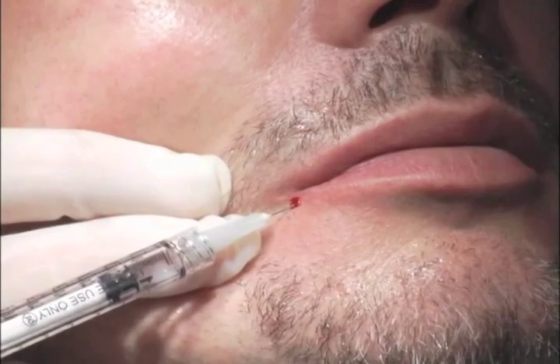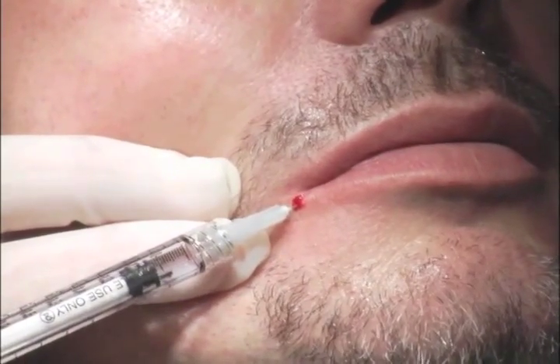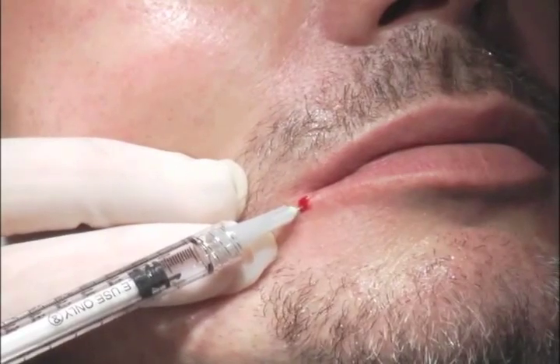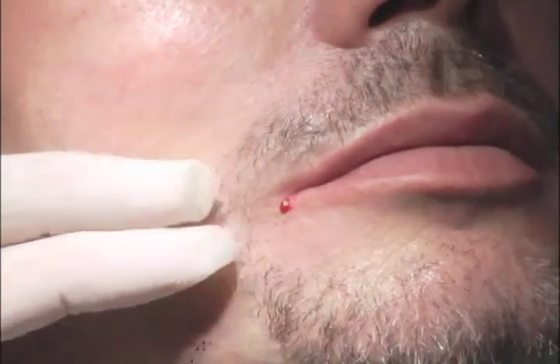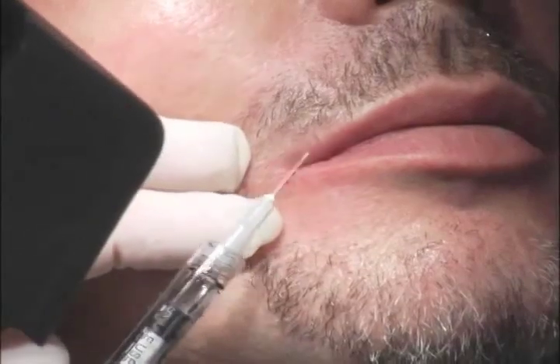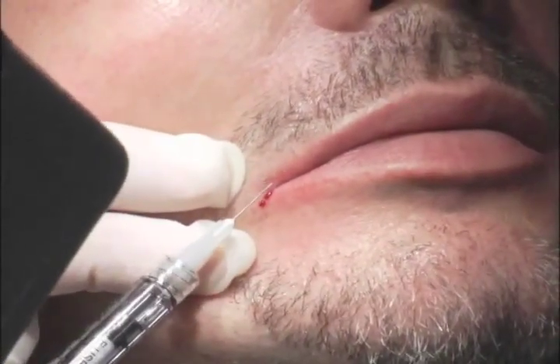Making sure we extend out the lower lip as well as lift up the lower third by connecting the space that was non-existent between the lower and upper lip. So as we go there, want to wipe that off. Just a whisper. So what we want to do is go into the space we went in, but going a little more into the upper lip.